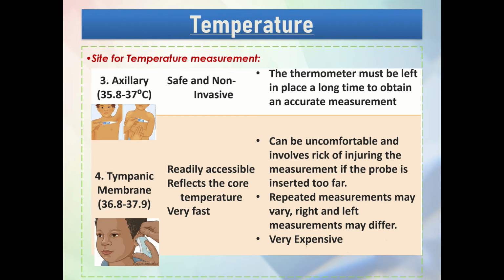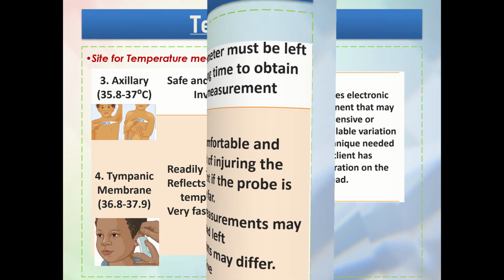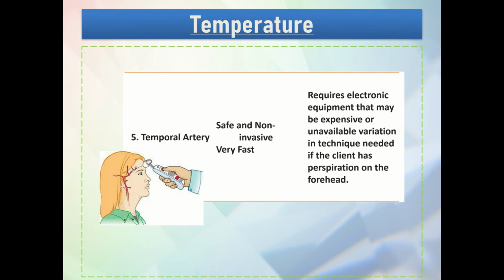And then the equipment itself is very expensive. Okay, so yung kanina, si axillary is the most common and inexpensive somehow yung ginagamit natin in the equipment in getting the temperature for axillary compared to the tympanic.